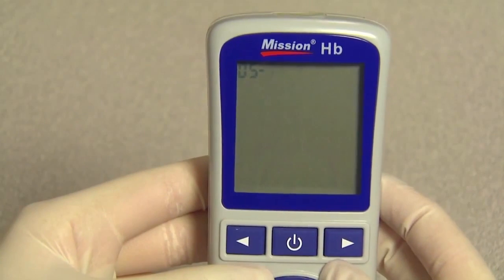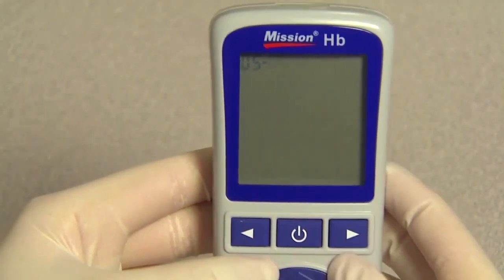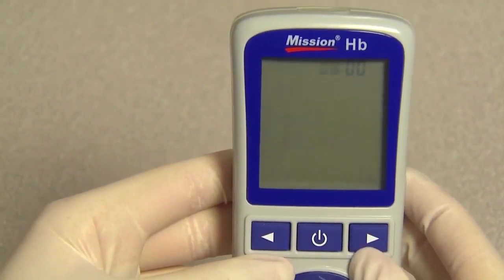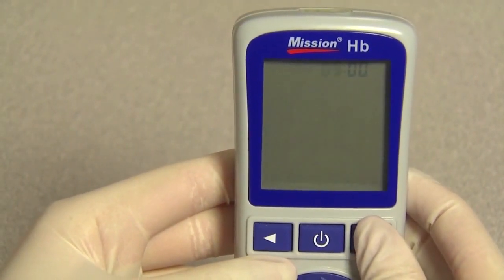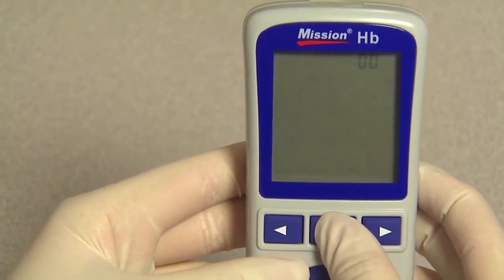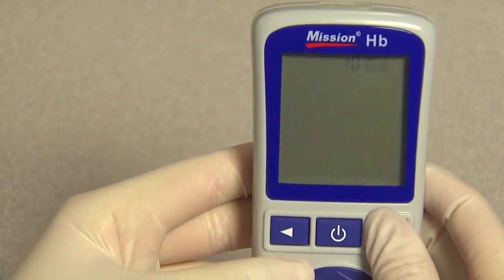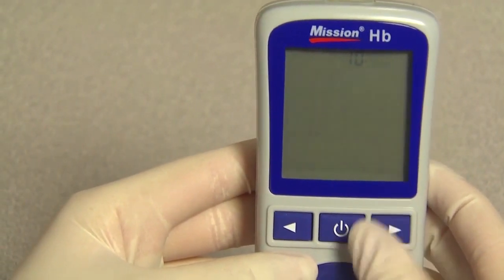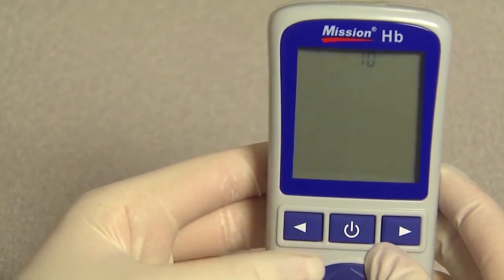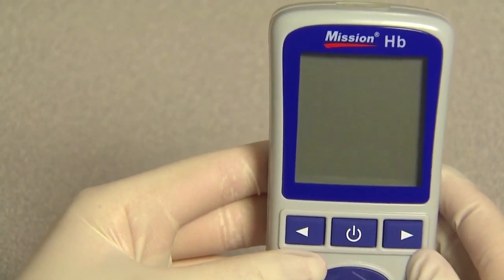Press right or left to choose the correct date. And then press the power button to save. Press right or left to choose the correct hour. Press the power button to save, and then proceed to choose the correct minutes. Press the power button to save the setting. After that, the meter turns off automatically.